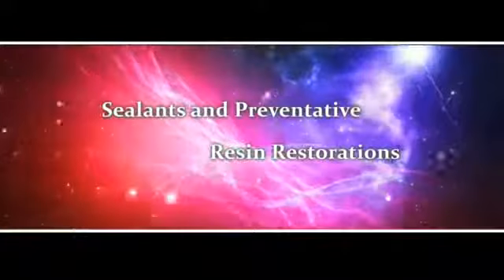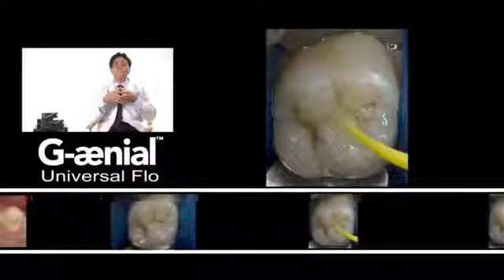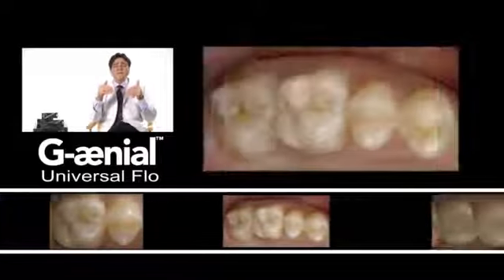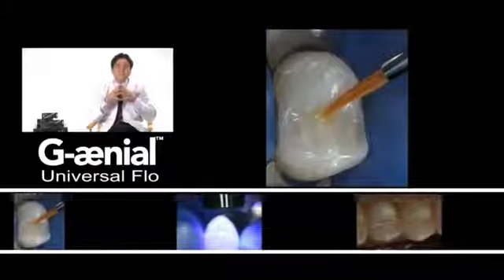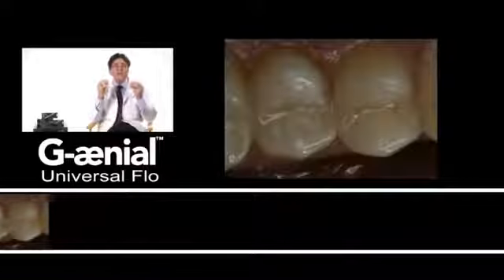As sealant and preventative resin restorations, next generation flowables can be utilized as composite surface sealants, pit and fissure sealants, and preventative resin restorations. These highly filled nanomaterial formulations can be cured in a thin film and have the potential to increase the wear resistance of posterior composite resin restorations, since the interparticle spacing is reduced and the filler particle density is increased, and thus can provide more reinforcement and protection of the resin matrix.